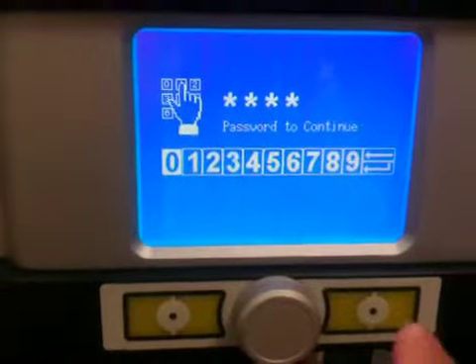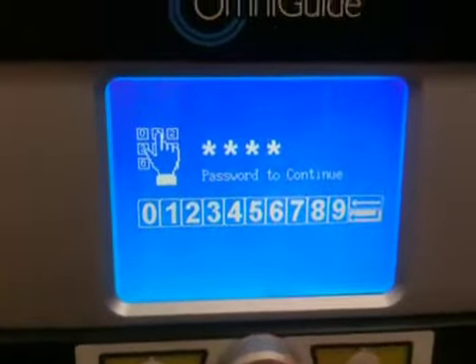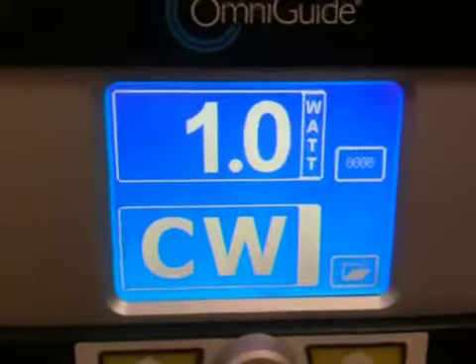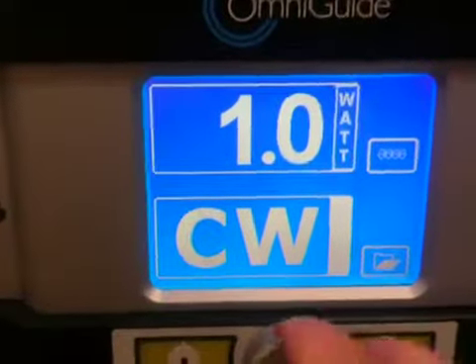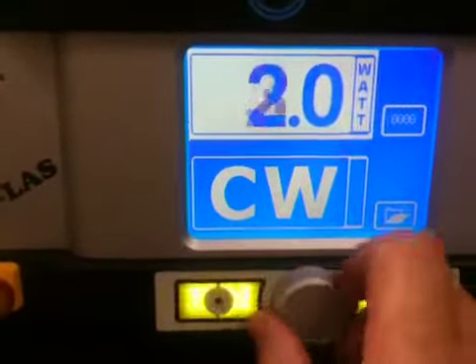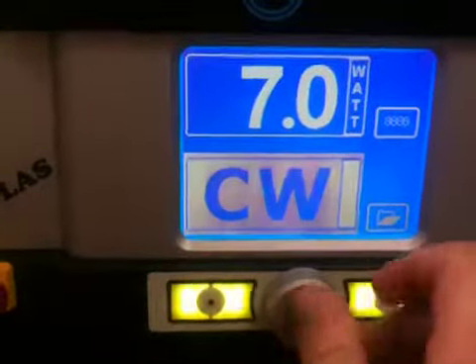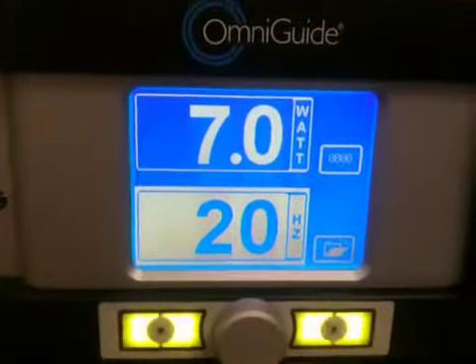I just turned on the laser and it started, and now I enter the password, and now I'm going into the settings. Okay, so this is the default setting that I see, 1 watt CW. If I leave it as that and I change it to 7 watts, 20 hertz, I fire a little bit.